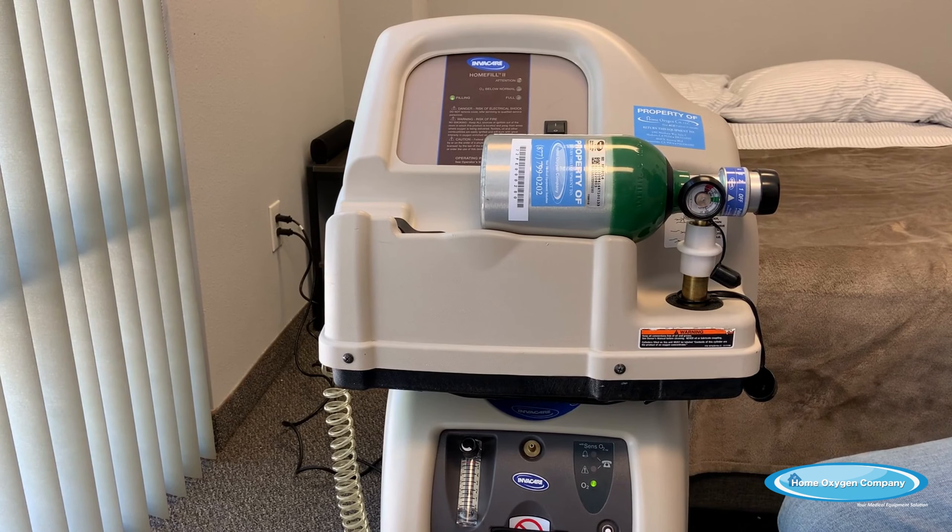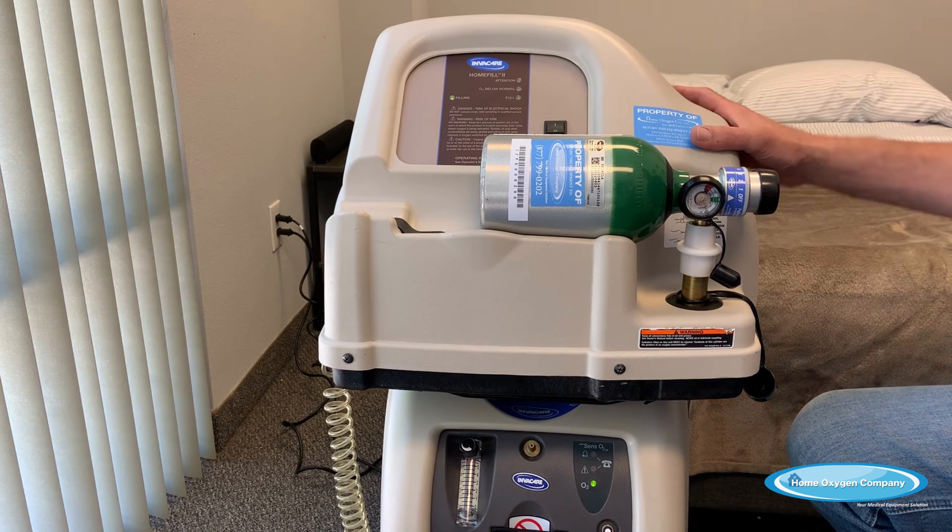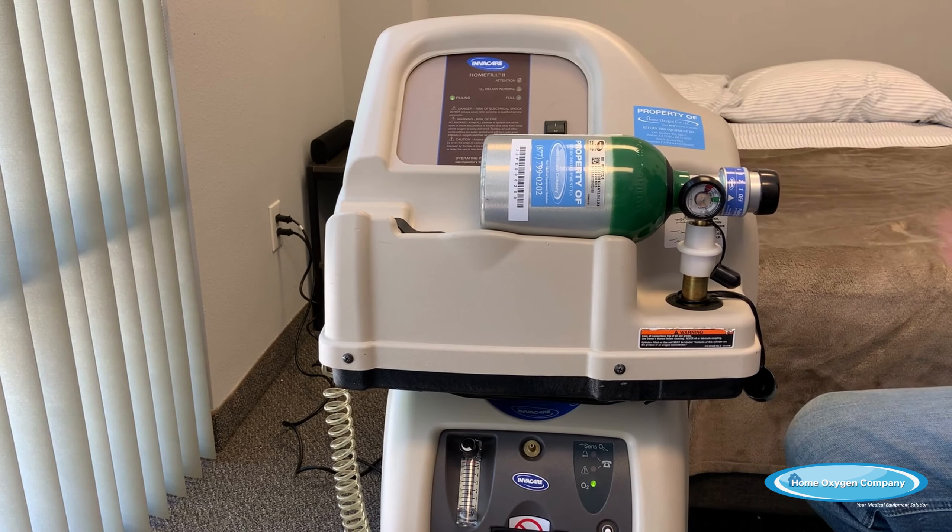With this system you don't have to rely on a third party to bring you more oxygen. This gives you all the ambulatory oxygen that you need to be self-sufficient during any national emergency.